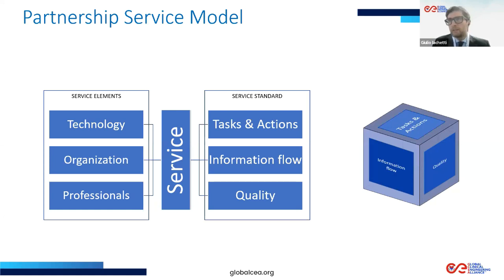Generally, like clinical engineering, we are focused on technology, organization, and professionals. We always have to think, when we speak about nuclear medicine department in general, that it is, I think, the most difficult diagnostic imaging department to think of because of task action, information flow, and quality.